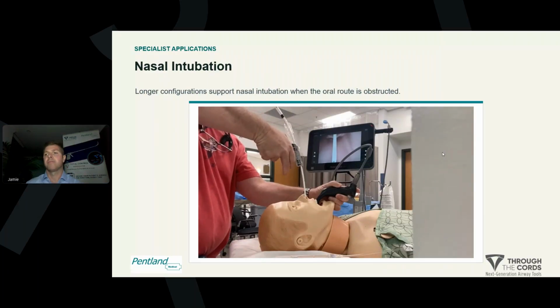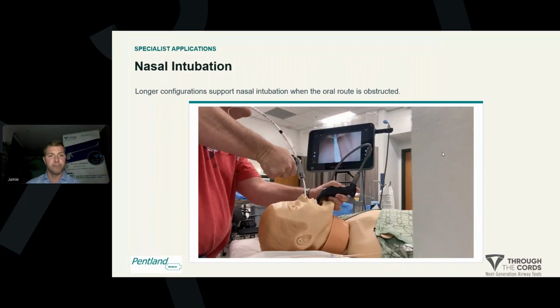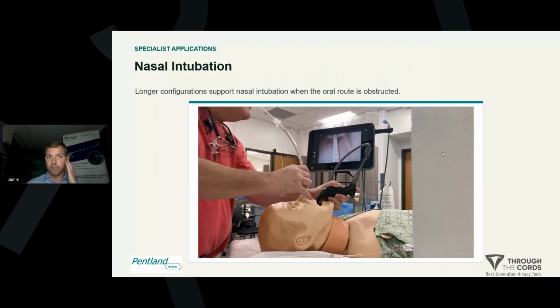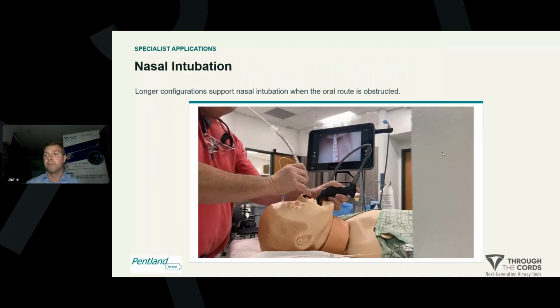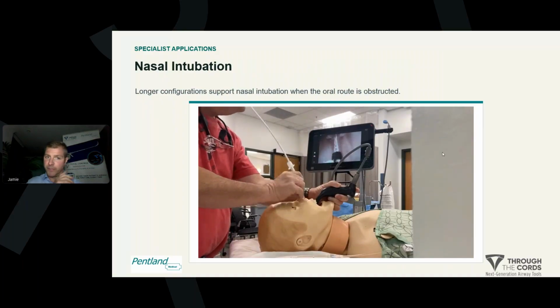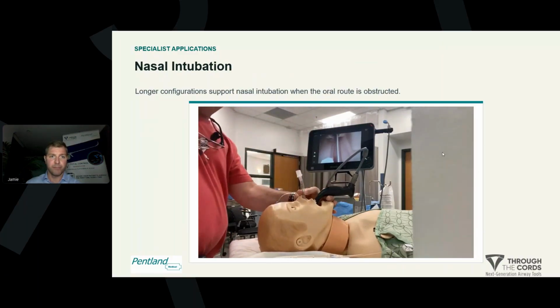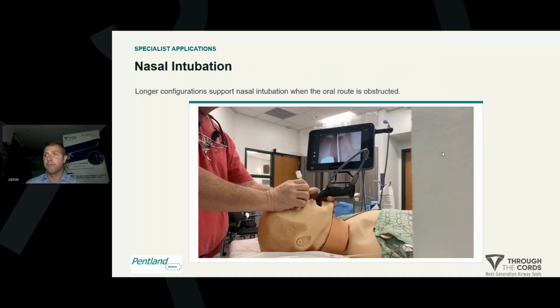I've solved that primary curve here, and so now I pull the trigger again. That brings the tip down into the trachea. Enter, and then I release the handle. Hear that click. And now the tube slides over and is railroaded into the trachea. And then once I'm in, I just release this and single operator nasal intubation. No McGills, no manipulating the head, no second operator.